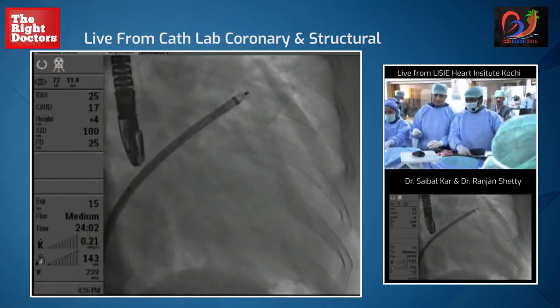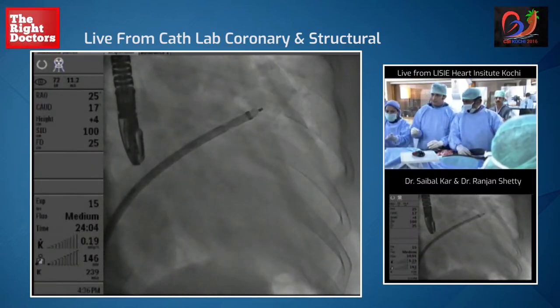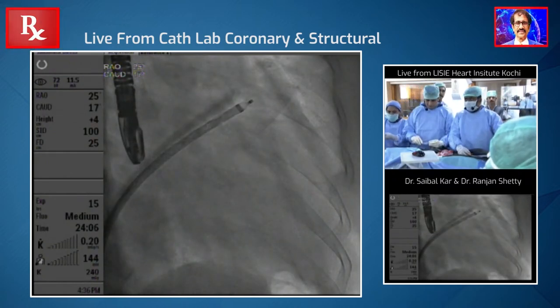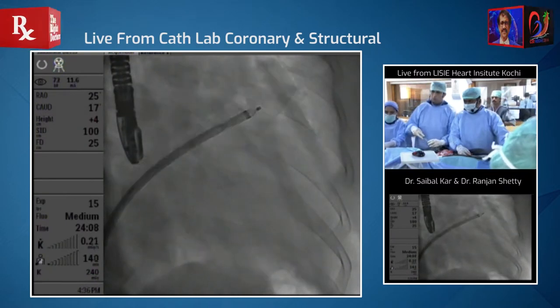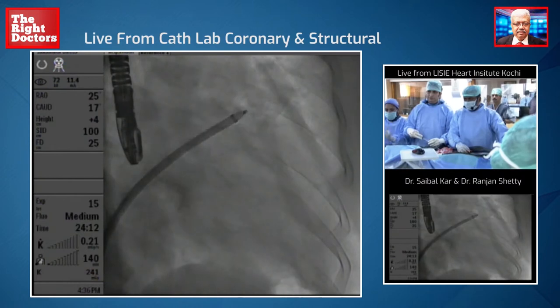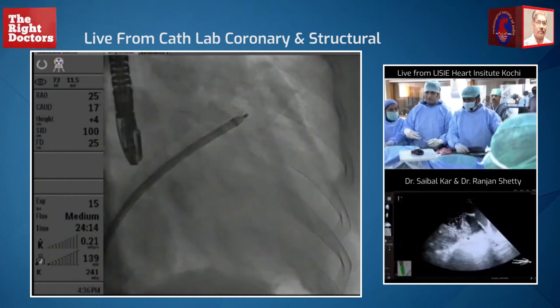As you can see, the device is just at the end of the sheath, and now we're going to give contrast and we're going to see how deep we are. We are very deep — so that's good. I'm going to come back a little bit, because that's pretty deep. We'll test again.